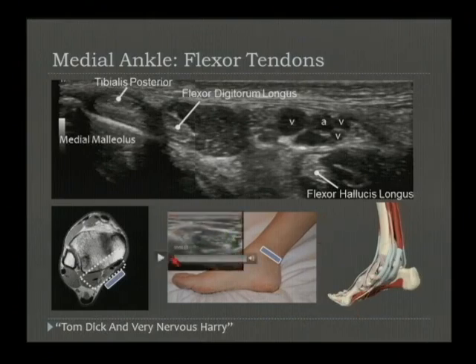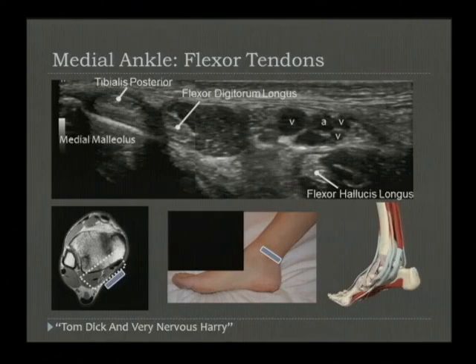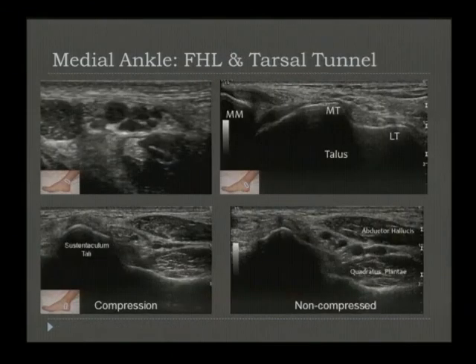Again, I think looking in the short axis is the best. Here you can see the tibialis posterior as it extends down to the navicular. Remember, as it makes its way to the navicular, it does split and branch. It actually fans out because there's a portion that goes to the navicular and then smaller branches that go to the cuneiforms as well as the 4th metatarsal. And so you have to make sure that you do not overcall tears at its insertion at the navicular.